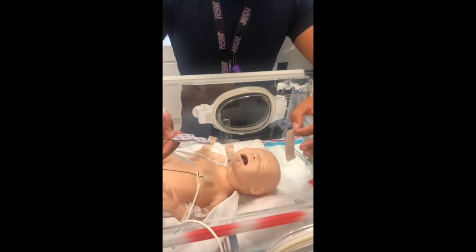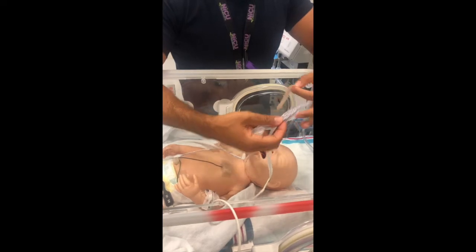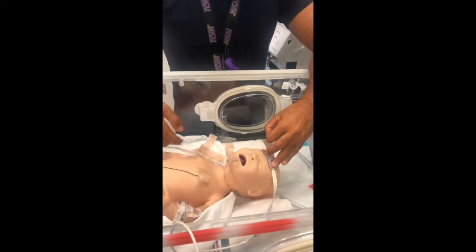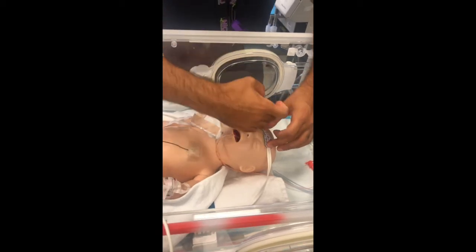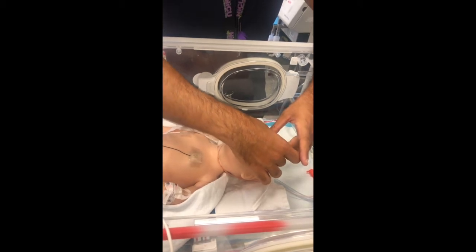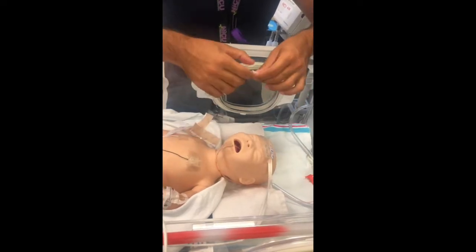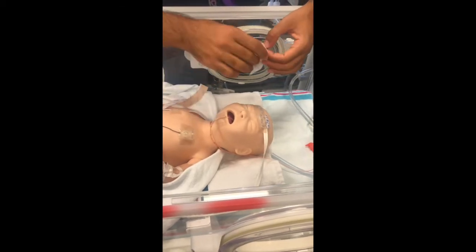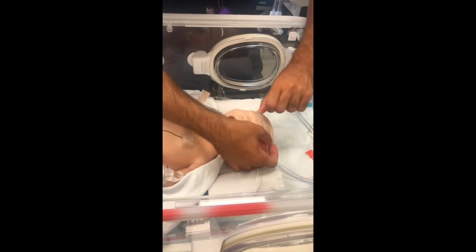For installation of sensor one, remove the little sticker from under it when it comes out of the package. Place it centrally just above the eyebrows so that it monitors at the level of the frontal area and frontal cortex. We typically solidify with some MEPITAC, trying to avoid the areas of the eyes — placing one strip below and one above the sensor.